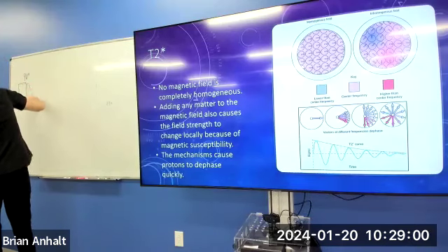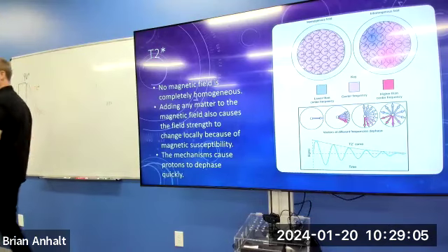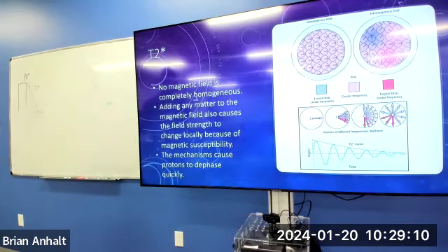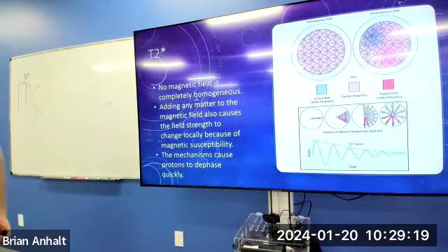If we graph the loss of that signal, that is called the T2 star curve, the T2 star decay curve. You can literally measure that. We just turn on a receive coil after a 90-degree pulse. We just measure how that signal goes away. That is the T2 star curve. Notice it looks different than an echo. It didn't grow, it just shrinks. We start off with no signal until we cause resonance. We excite via resonance. Get a lot of signal that decays quickly.